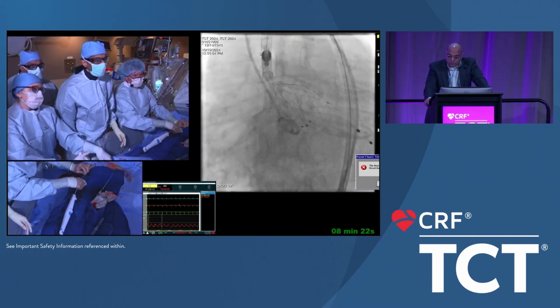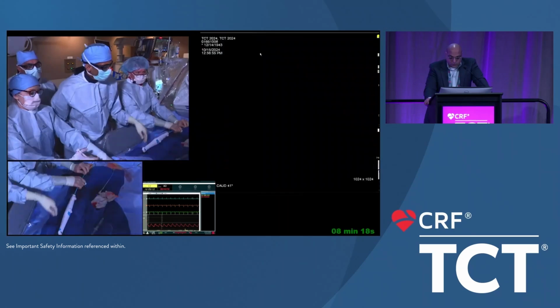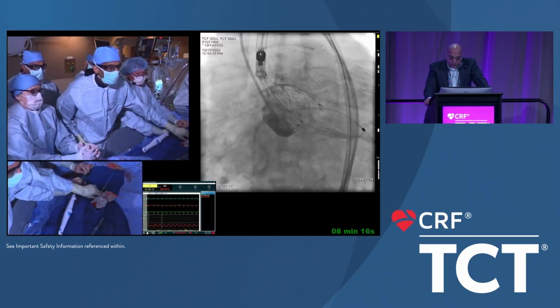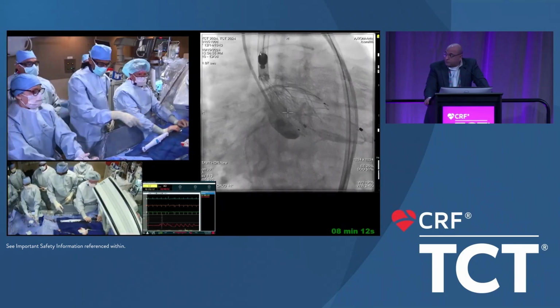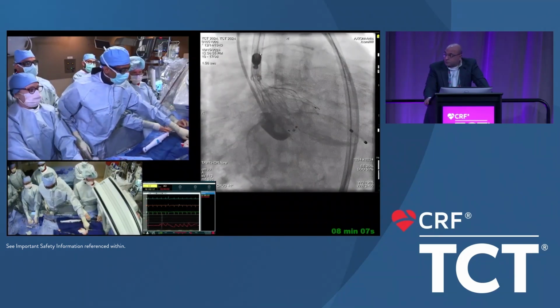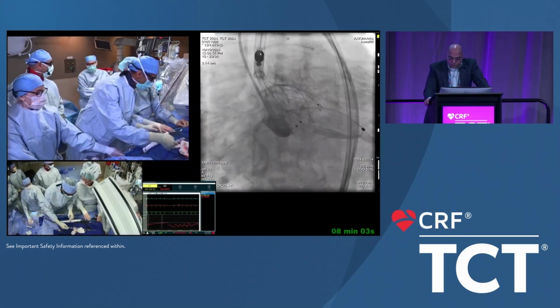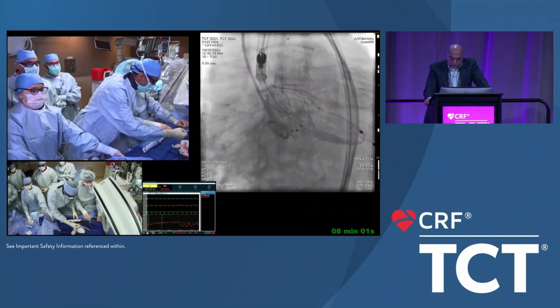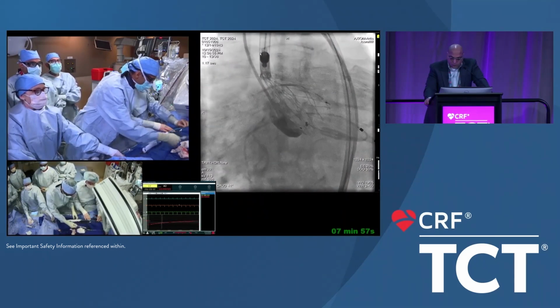So what we're trying to say is I think this valve needs to be deployed with the 2 cusp overlap, right, guys? I don't think we should deploy it with anything else. 2 cusp overlap is a must for this valve, and it's crucial in my opinion. The flush port at noon will give you almost 50% commissural alignment, so it's not 100% accurate.